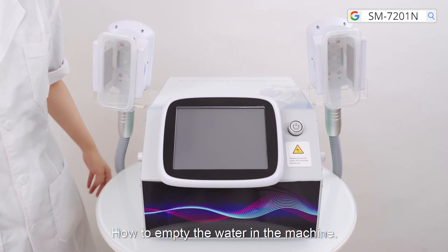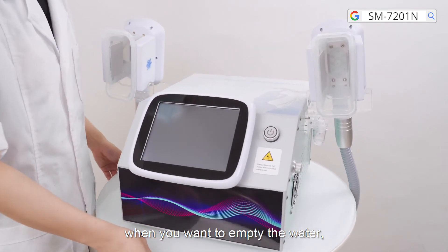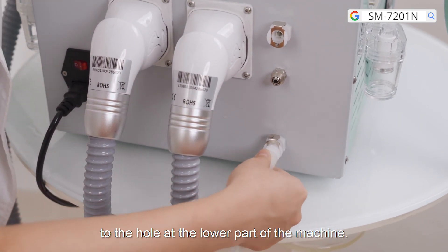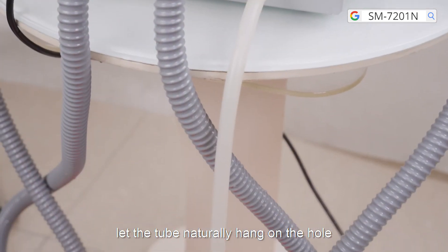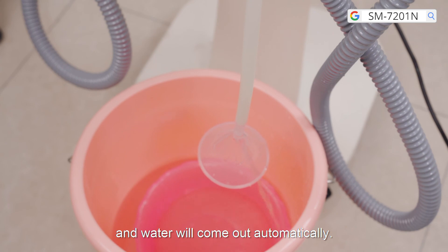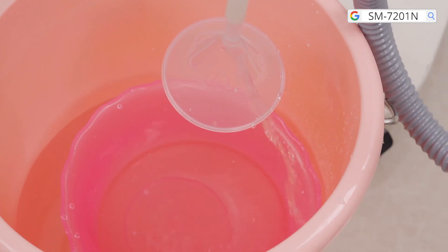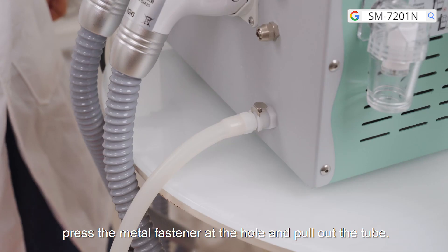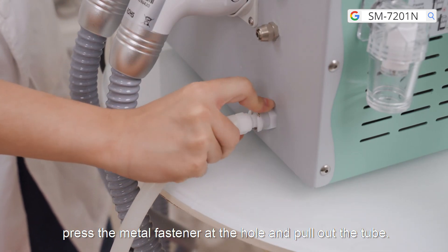How to empty the water in the machine: connect the narrow tube at the bottom of the funnel to the hole at the lower part of the machine. Let the tube naturally hang at the hole and water will come out automatically. When the water is emptied, press the metal fastener at the hole and pull out the tube.